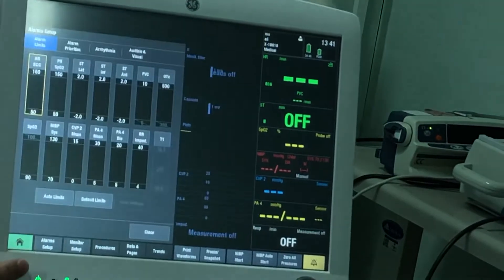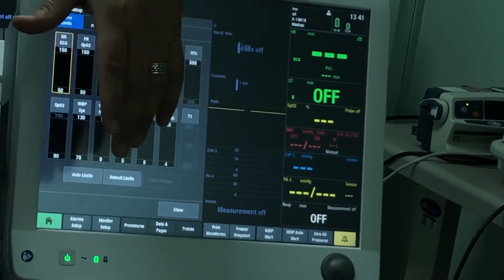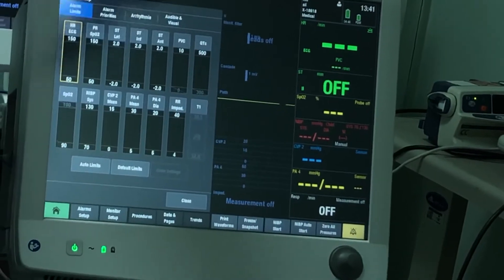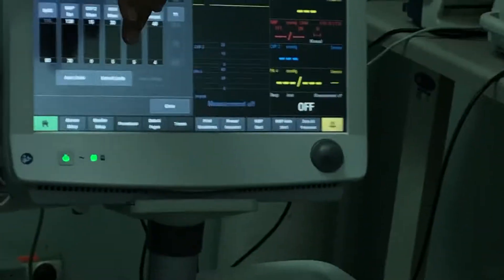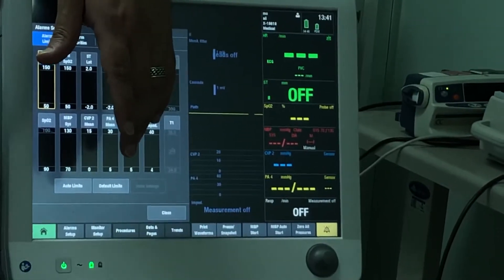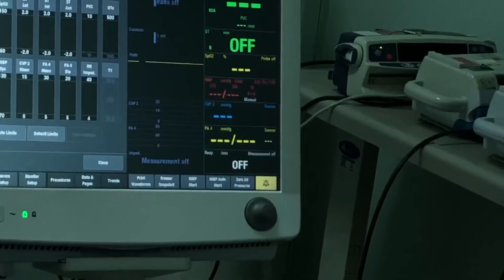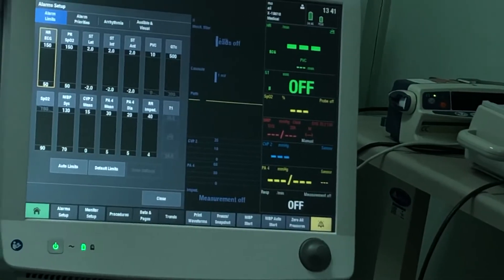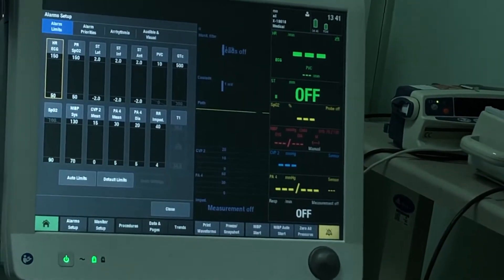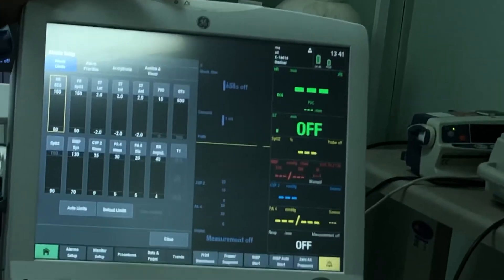Now let's talk about the alarming system. Under alarm setup we have two sides: alarm limits and priorities. Alarm limits are basically the lower and upper limit for each parameter, and whatever is in between is considered the normal range. For example, the heart rate is from 50 to 150 for an adult patient, so if the heart rate goes below 50 the monitor will alarm indicating bradycardia, and if it's above 150 it will alarm indicating tachycardia.